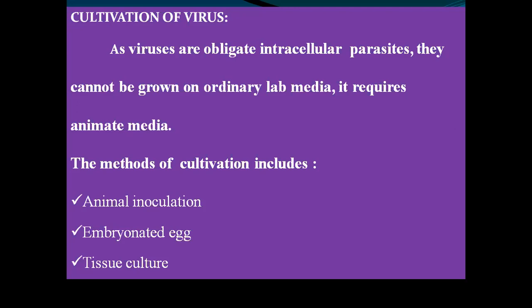As viruses are obligate intracellular parasites, they cannot be grown on ordinary laboratory media. They require animate media, which means cell culture media.